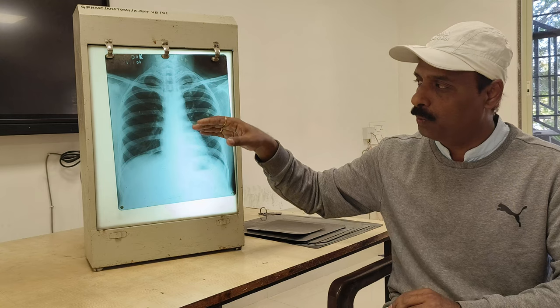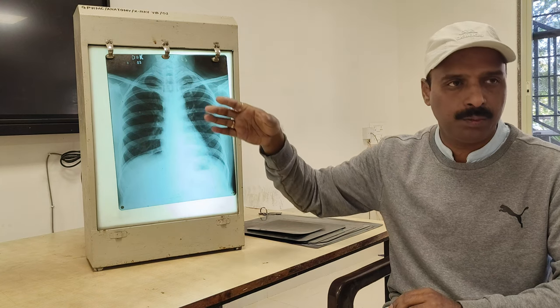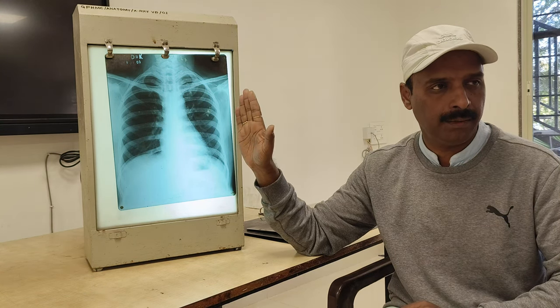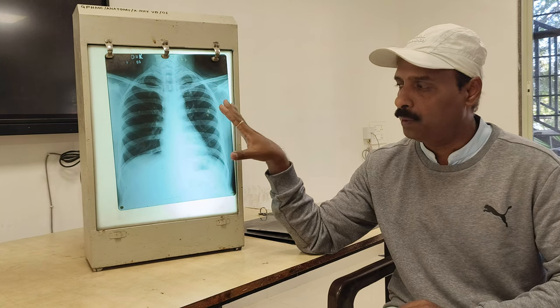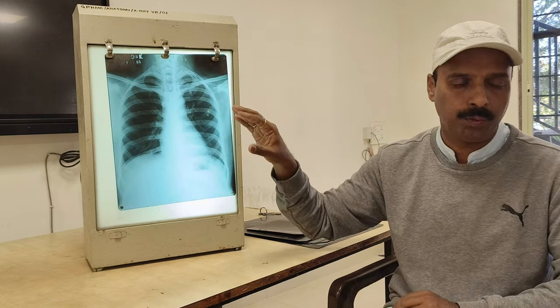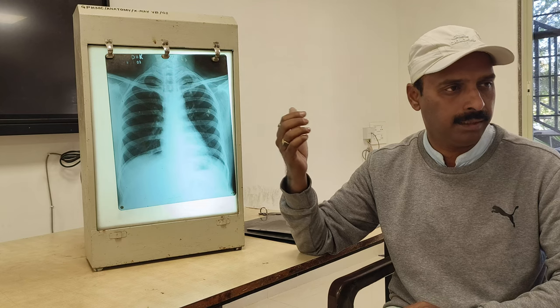Second, if we want to visualize the posterior structures, we pass the rays from anterior to posterior, and the posterior structures of the body are seen very well. Then the lateral view, when we take it from the lateral side. We even have oblique planes and oblique views, which you also have to remember. When an x-ray is displayed, you have to say what type of x-ray it is. Second, you have to mention the structures seen. Then you can mention what abnormalities are seen in that x-ray.